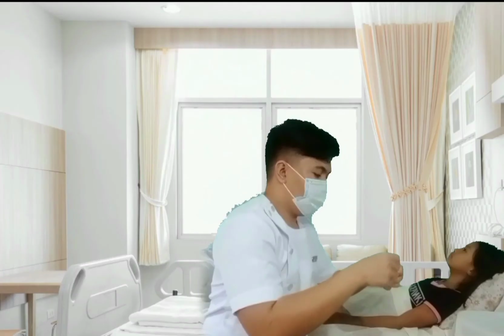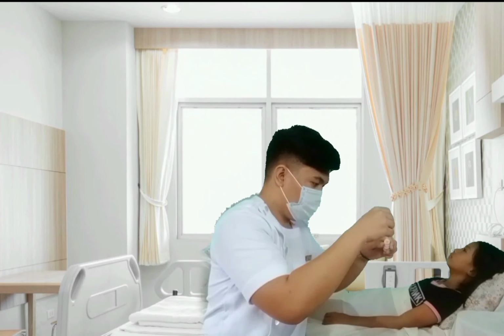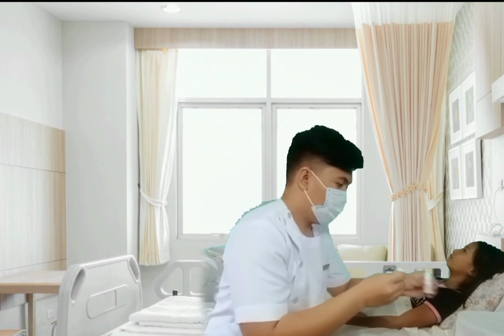Step 10. Draw sufficient solution into the dropper for both nares. Do not return excess solution to a stock bottle. Returning solution to a stock bottle increases the risk for contamination of the stock bottle.